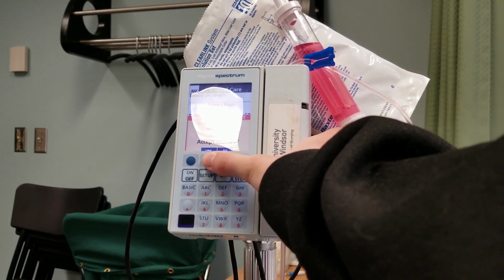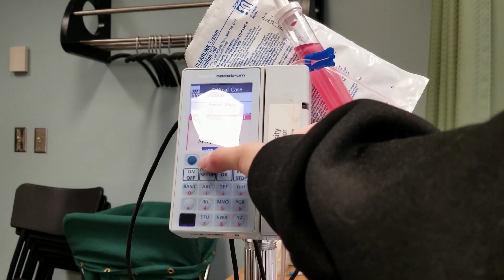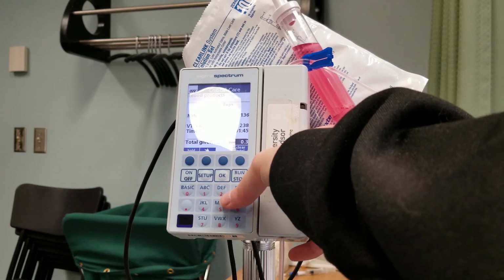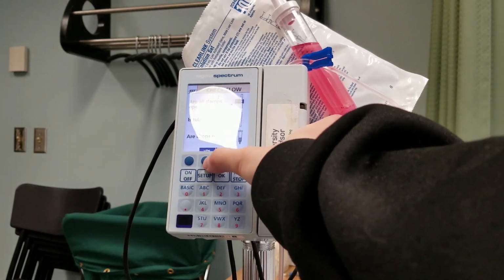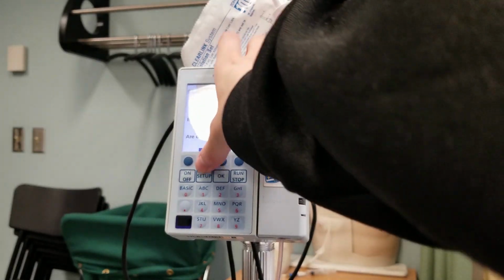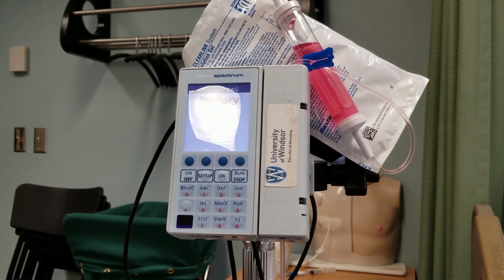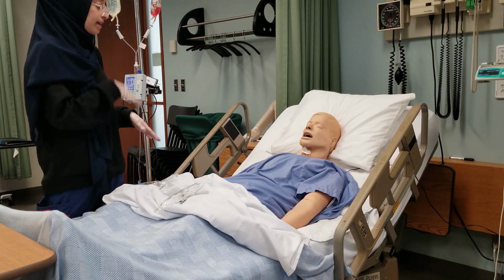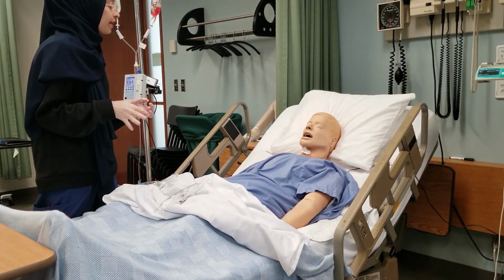It's double checking with me, hey, you're changing the rate by a lot. Are you sure you want to do this? I click yes. And then I go ahead and restart my infusion. So now we're running at our final rate. That's just going to run for another hour and 45 minutes.